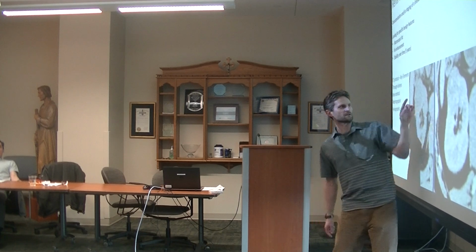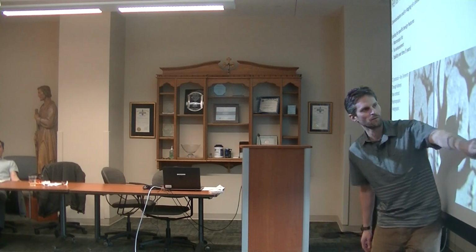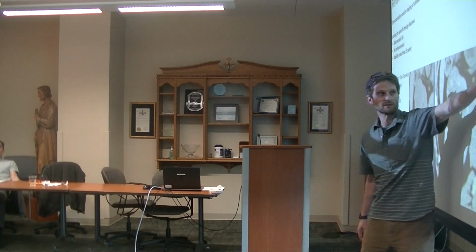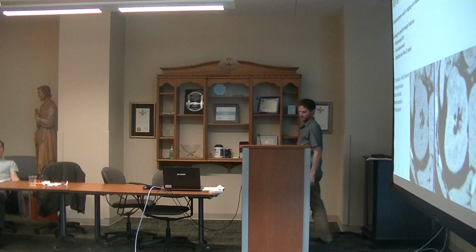So this is the multiple phases. This is the non-contrast, nephrographic, pyelographic phase. You don't really see it well, but you see the contrast in the collecting system. And so you see all the enhancing tissue in the center of this mass. So that's basically what we're looking for.